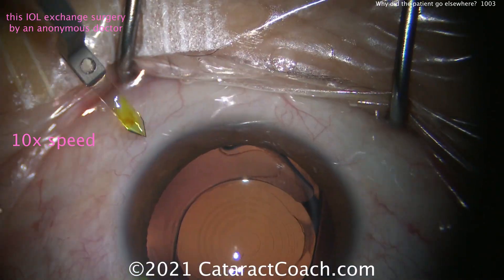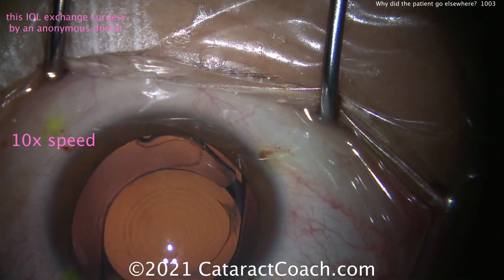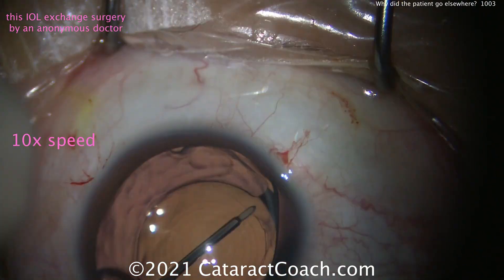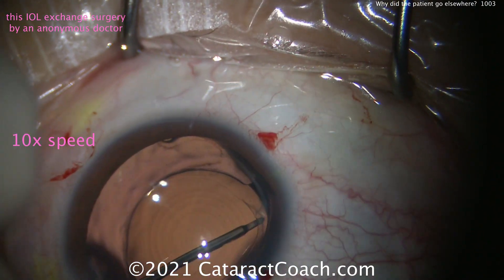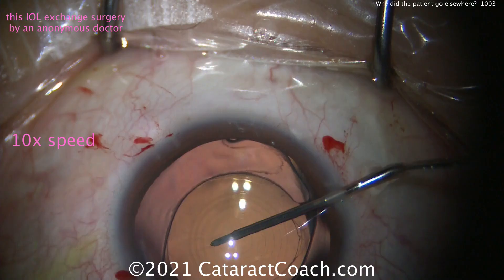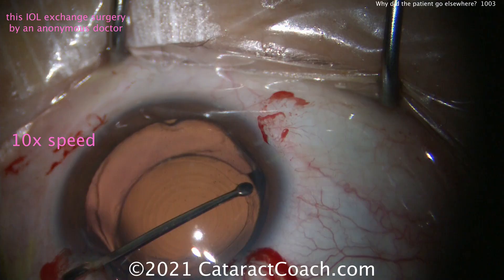Here's the IOL exchange surgery. It's interesting starting off with one, two, three, four paracentesis incisions — that's a lot of paracenteses, but that's okay. This surgeon has decided to take out this trifocal lens and replace it with a monofocal lens instead. Again, a reasonable approach.